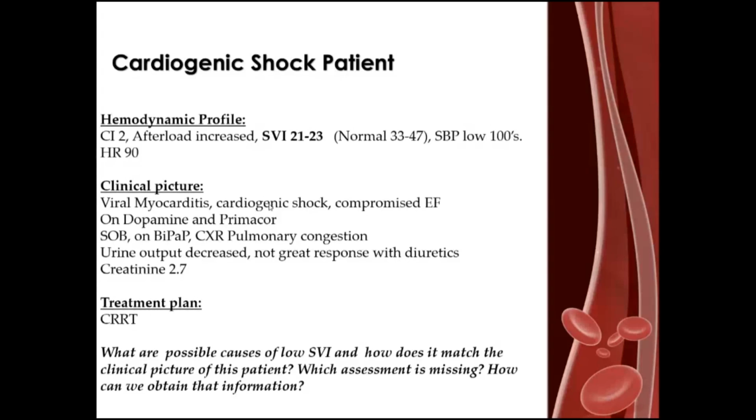He's going to need dialysis, but his hemodynamics are so compromised that he wouldn't handle conventional hemodialysis, so that's why they decided they're going to do CRRT. I just happened to be in the room next door when they delivered the supplies for the CRRT, and that's why I know they were going to do that. And as I walked past the room and glanced into his room, I saw the numbers on the NICOM, and I remember thinking, I don't know how he's going to tolerate this.